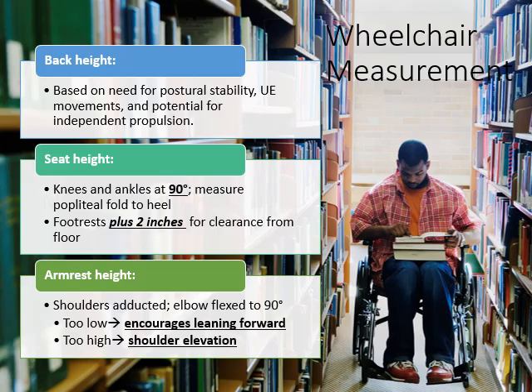The back height is going to be dependent on the user's needs and abilities. If they have good postural control, they can get away with a shorter back height, but they may need a taller or longer back, a higher back, if they lack postural control and need more supports to maintain an upright position.